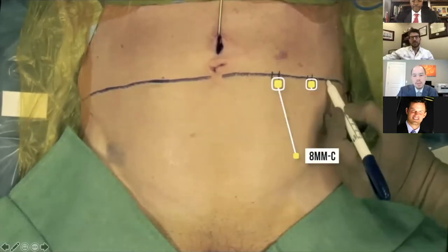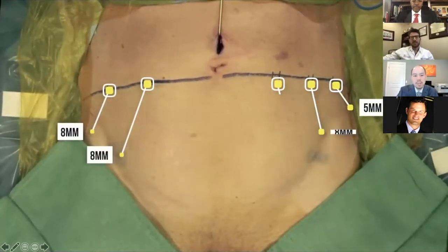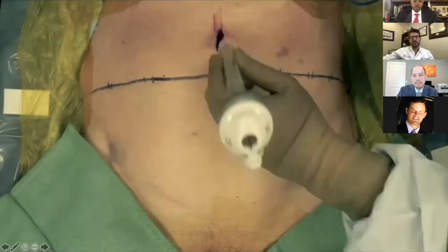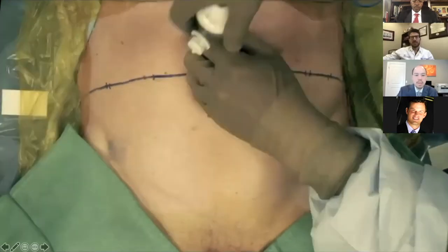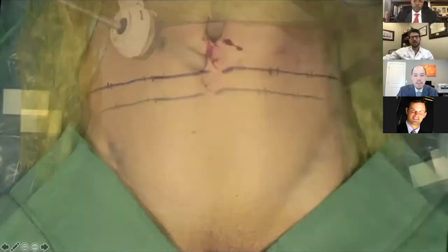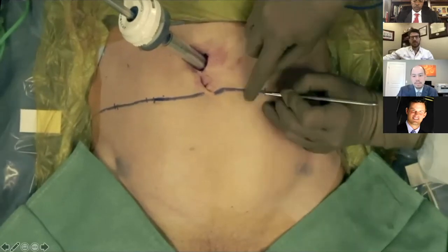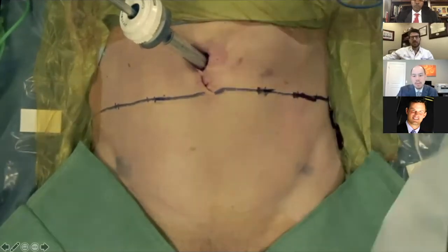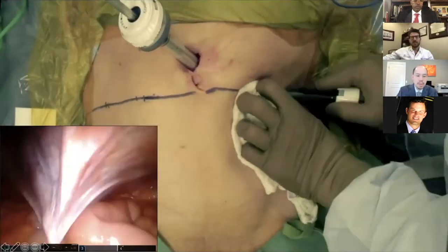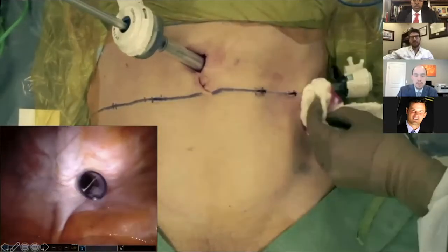We draw a straight line underneath the umbilicus. We have two 8 millimeter ports on the left-hand side with a 5 millimeter port laterally for assisting, and then two 8 millimeter ports will be placed on the right-hand side. Once insufflated, we place the 12 millimeter air seal port, then the camera, and the rest of the ports are placed under direct vision.